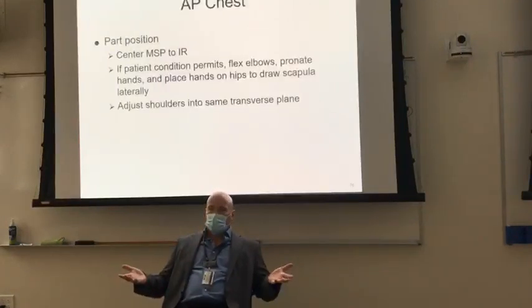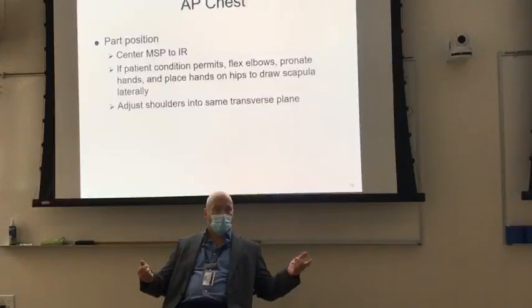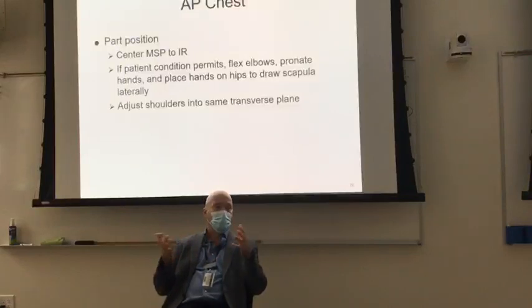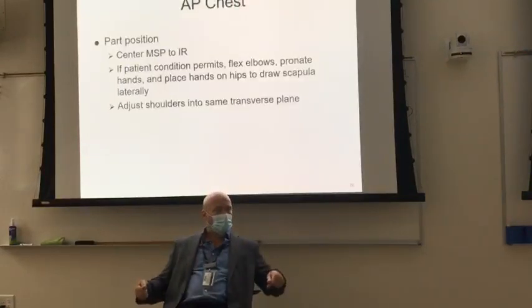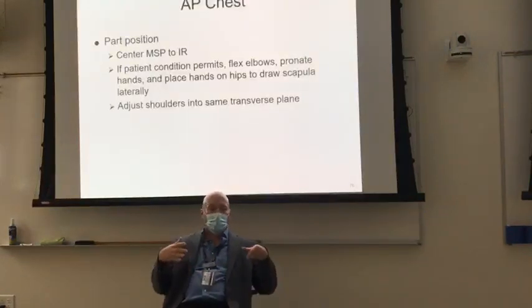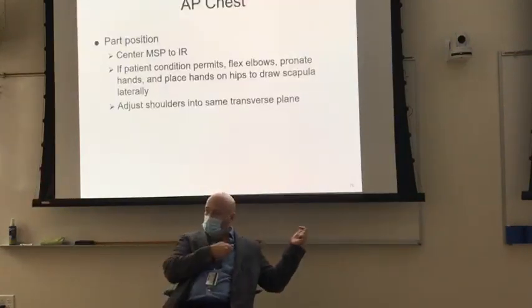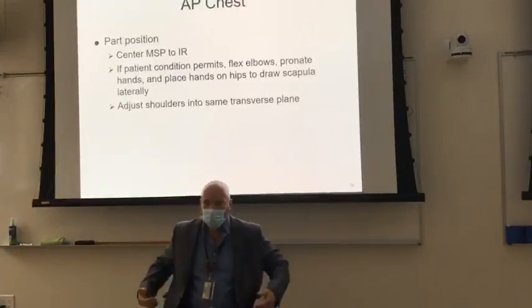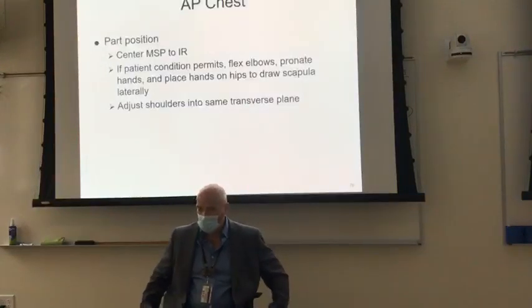So you take the draw sheet, and you got somebody working with you. Usually there's two people, a lot of times there's two people on portable, and with you as a student, there's always going to be two people on portable. So both of you get on either side of the draw sheet, lay the bed down, tell the patient to bend their knees and push while you pull them up in bed, okay? Now you can sit the bed back up straight and the patient, put their hips right in the bend of the bed.